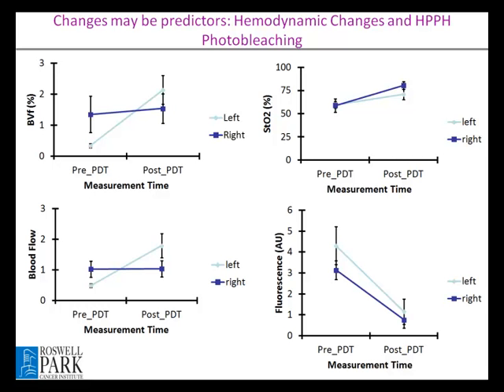Blood volume fraction is also about 2% to 4% in the head and neck lesion. That is the reason we chose that equation. But from there, you can come back to the oxy and deoxyhemoglobin part. In Arjun's lab also, we were fitting oxy and deoxy, like what you are doing. But right now, we find this just convenient. But still, you can go back and forth.